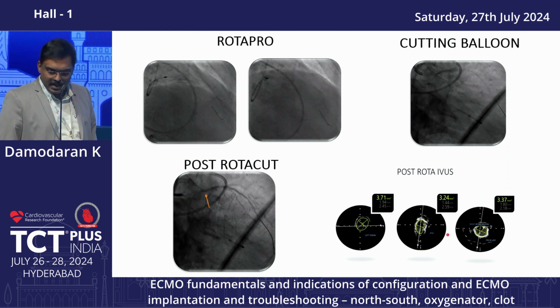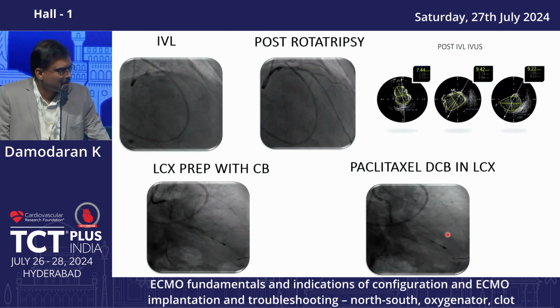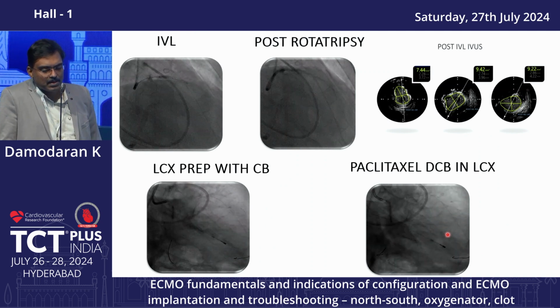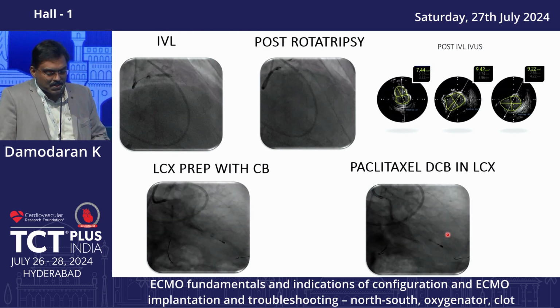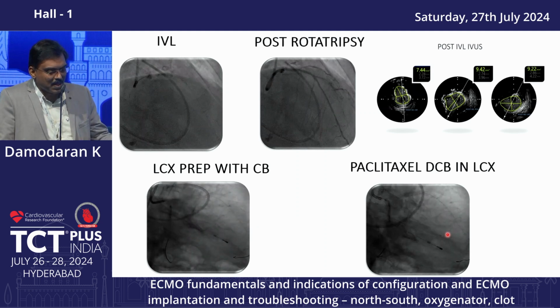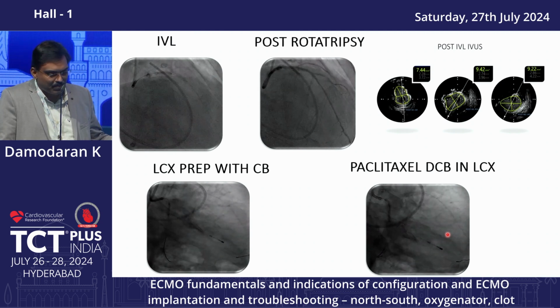Then we went ahead again with IVL. As the panelist and the chairperson told very well, I could observe that whenever you are doing IVL in such patients of a prolonged ischemia, prolonged inflation, during rotablation I didn't have any issues, but during the IVL the patient went in for sudden, not a gradual, hypotension, because the patient was already on 2.2 liters of ECMO flow.